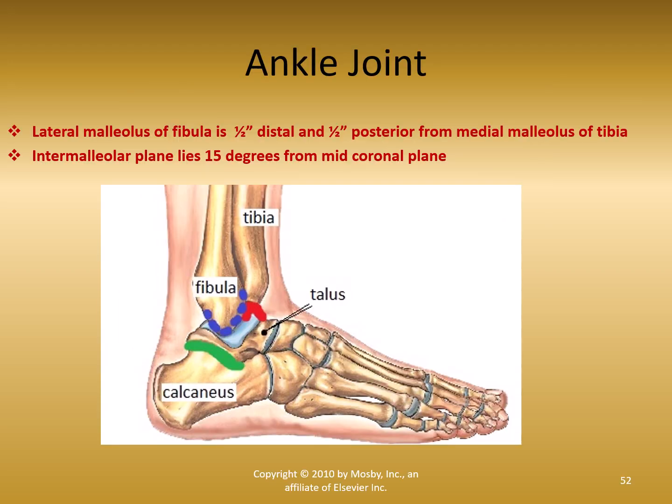All right, so now when we start looking at these images of the ankle, we can see what we've been talking about with the superimposition of the tib-fib, because we can see the tibia here and then the fibula here, right? So we can see how that fibula is superimposed over the posterior half of the tibia, even in this picture.